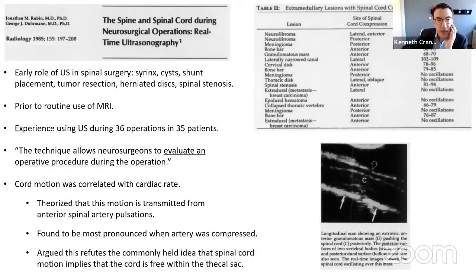Yeah, I mean, it can certainly be useful, and we've certainly seen that as an example, because we as an institution frequently say there's a patient who has a spinal cord injury and we treat it anteriorly initially, but they have a lot of cord swelling on their MRI. We'll frequently turn them over and do a posterior decompression and potential fusion as well.